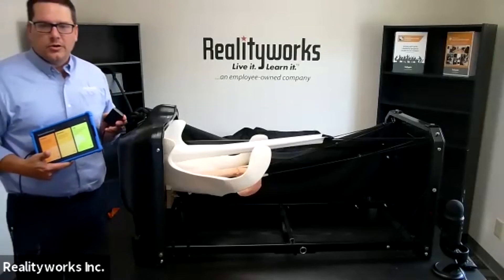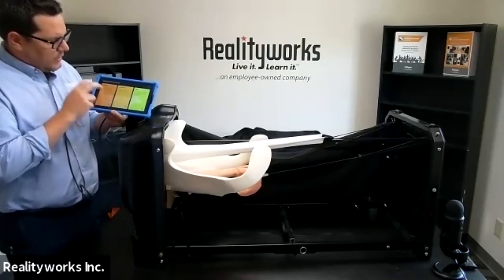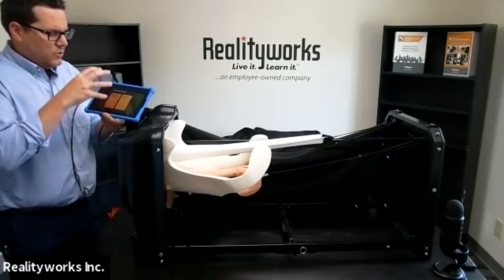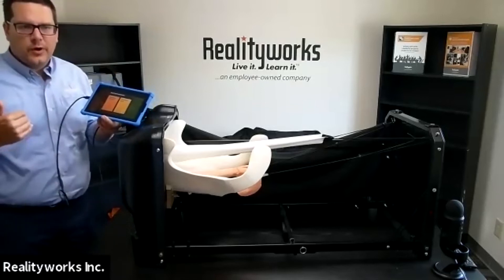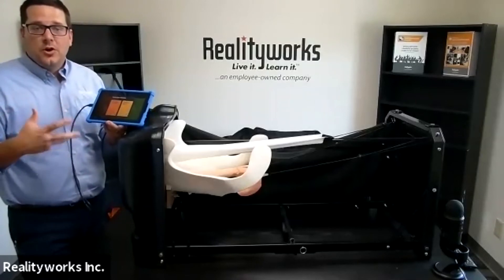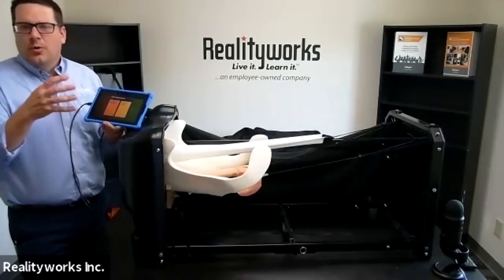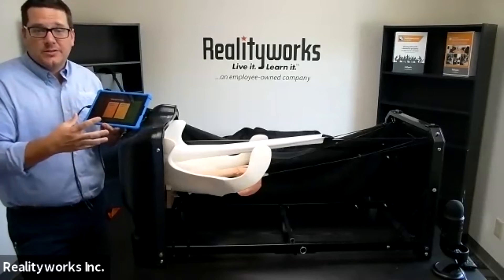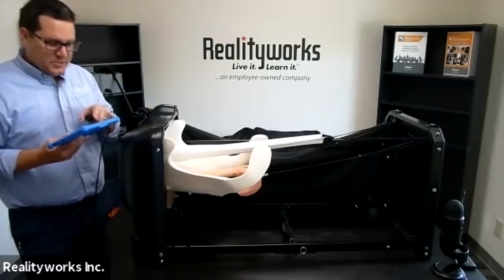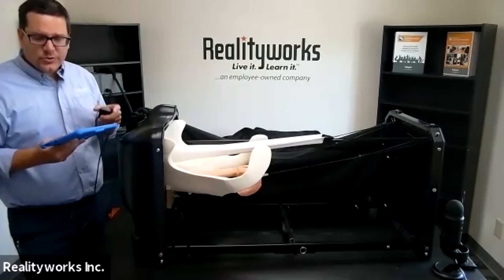We have our ultrasound probe, and on here we have different areas: practice, simulation, and test. In practice we have pregnancy diagnostics and we can also diagnose issues. This is not something where a student will fully master all the ins and outs of ultrasound — it's letting them see what a pregnancy looks like at 30 days, at 70 days, and identifying different things. You can select an animal coming into heat, during heat, a pregnant animal, see both male and female at different days, and also see twins.